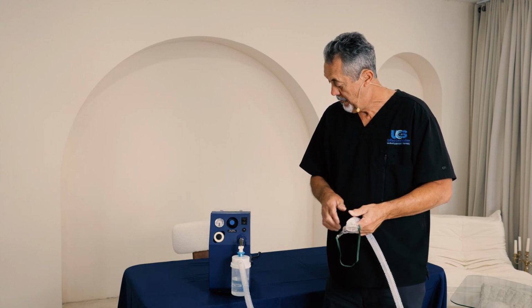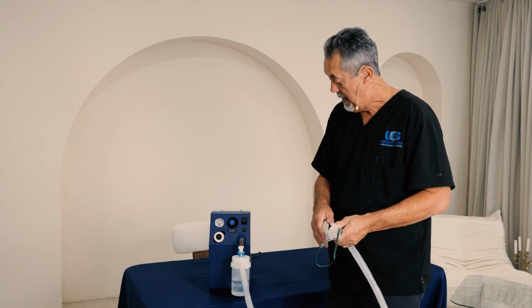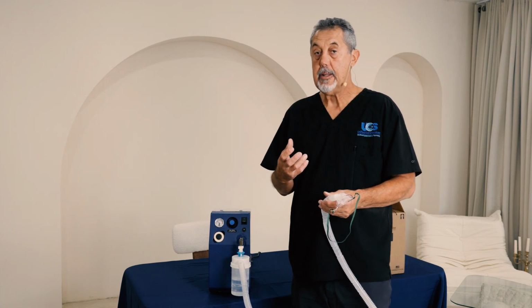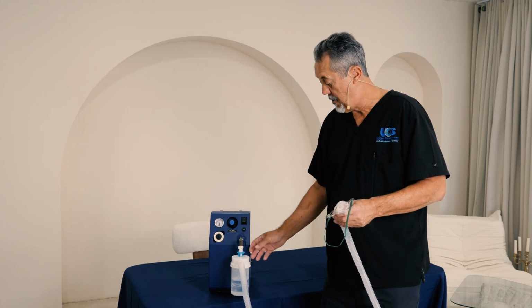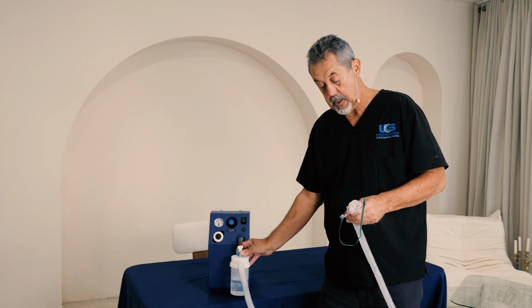So when you actually turn this thing on and put it on the patient, you want to make sure that you have enough flow coming out of here to meet or exceed the patient's inspiratory demand. And the way you can determine how much flow is coming out of here is by taking this blue dial and turning it in one direction or the other.